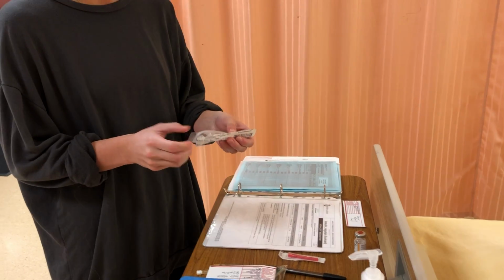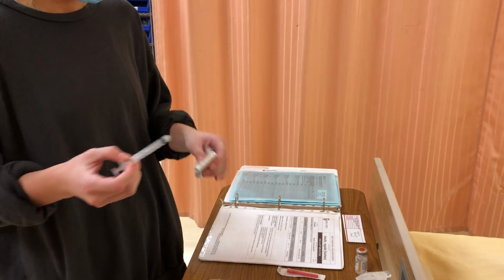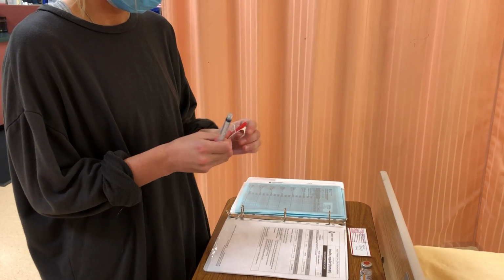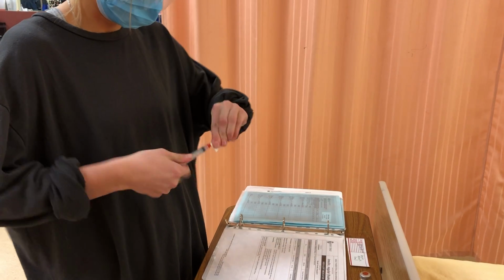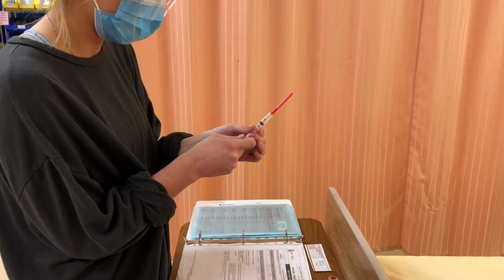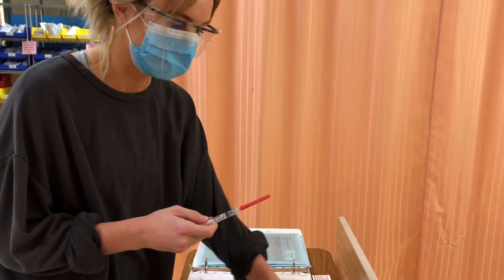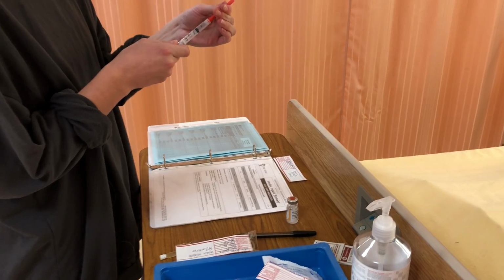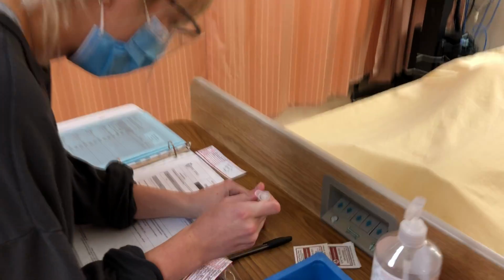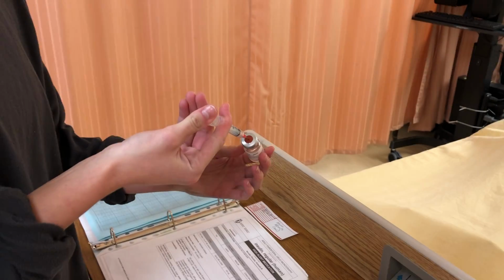And now, making sure we're remaining sterile, I'm going to draw back the 1 ml of air. So we have 1 ml that I'm going to be injecting into here. We've already cleaned, so I have 1 ml. Making sure I'm remaining sterile, and then I can inject that 1 ml.